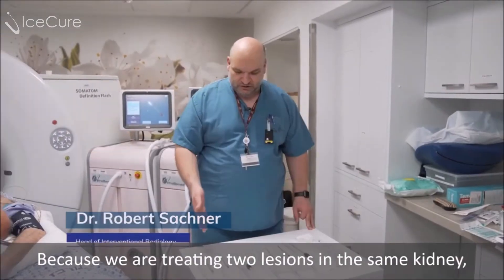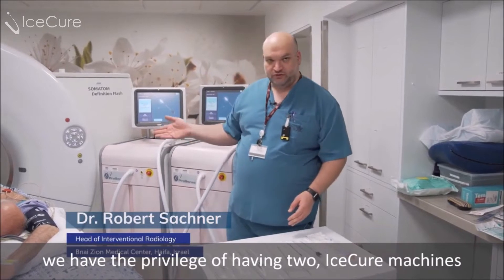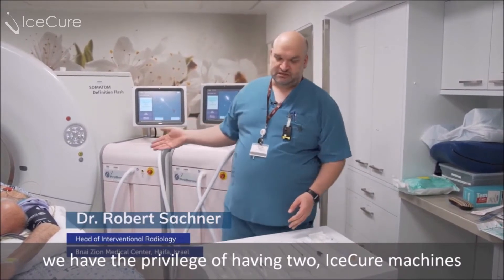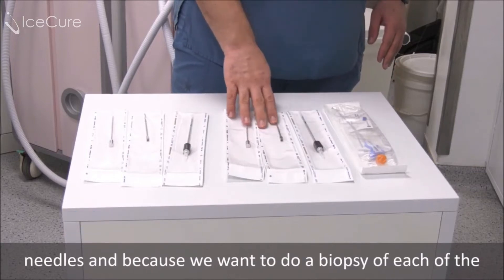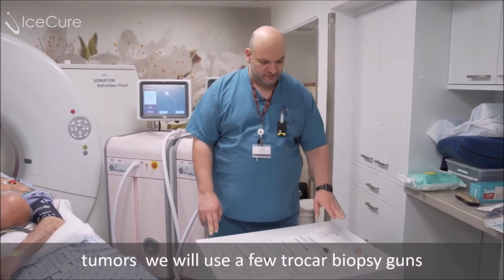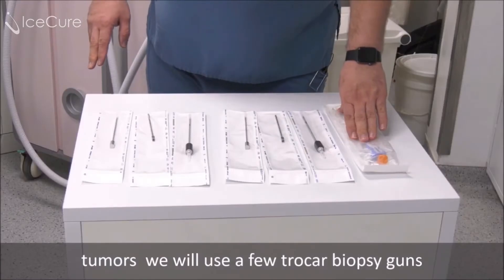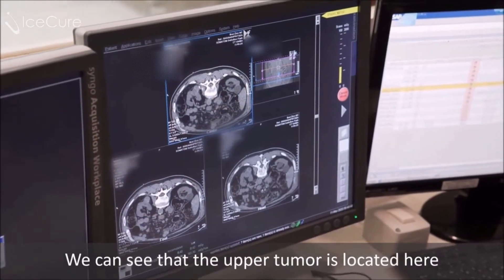Because we're treating two lesions in the same kidney, and we have the privilege of having two ice-cure machines, we will use two cryoprobes with their matching introducer needles. And because we want to do a biopsy of each of the tumors, we will use a few true-cut biopsy guns.